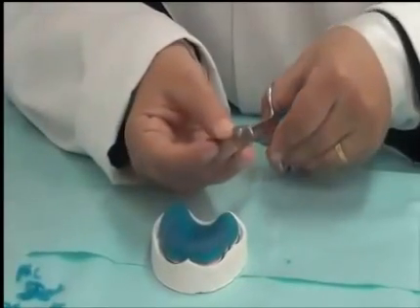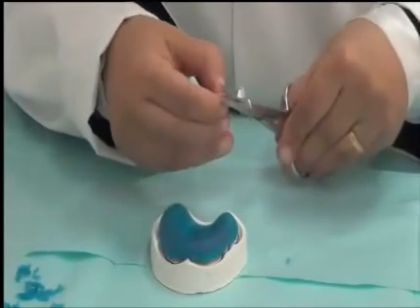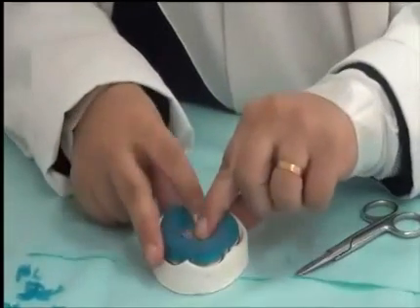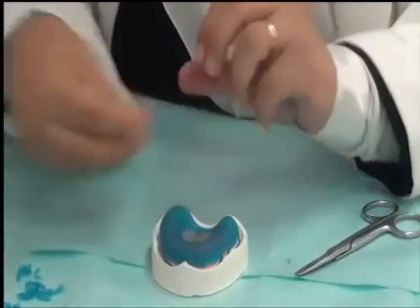So before light curing, we can add any material that is opaque and cut it into this shape and just add it into the palatal area. This will reduce the shrinkage while we are doing the light curing of the material.